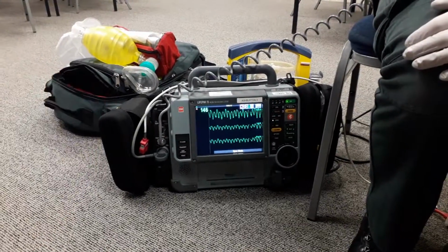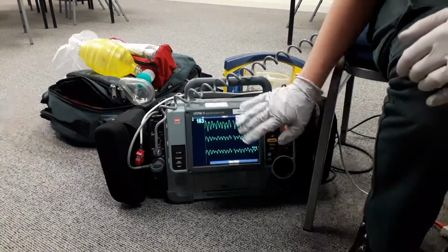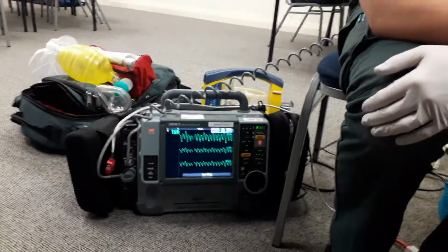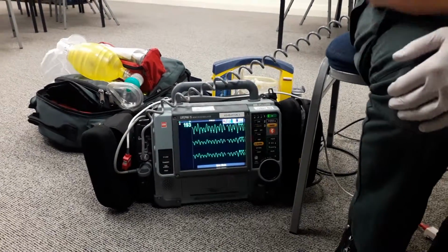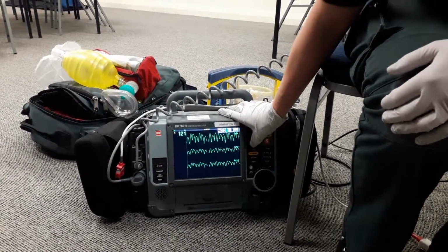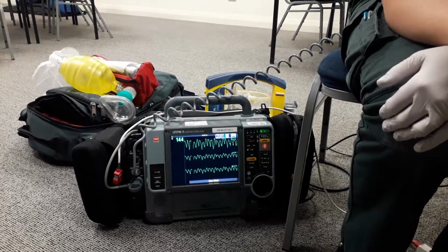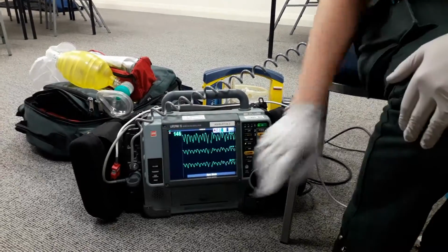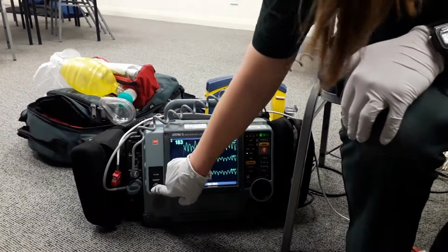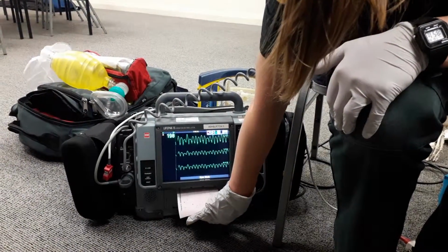Select a lead with a visible R wave and ensure that artifact is minimised. So we've got no artifact and I've got a lead with a good visible R wave. Select synchronised mode. Selecting synchronised mode now. There we go. Confirm there is a detection symbol above every QRS complex. So I can see there is a detection symbol above every QRS complex. I will just print a rhythm strip to confirm.